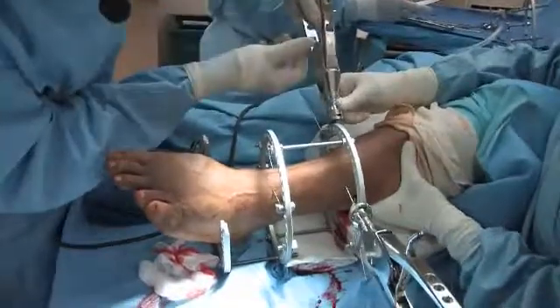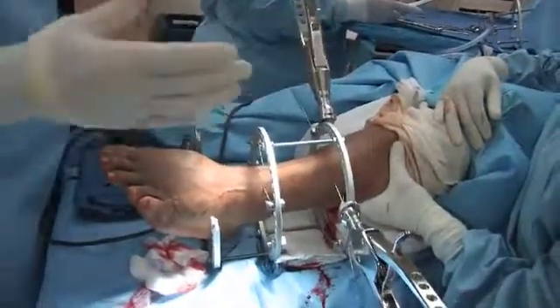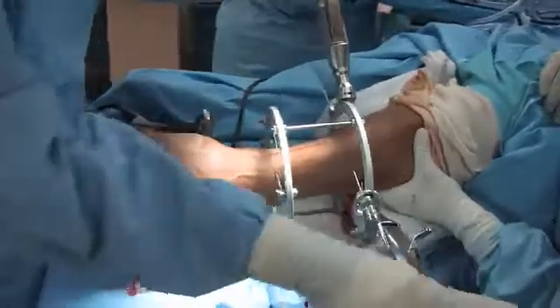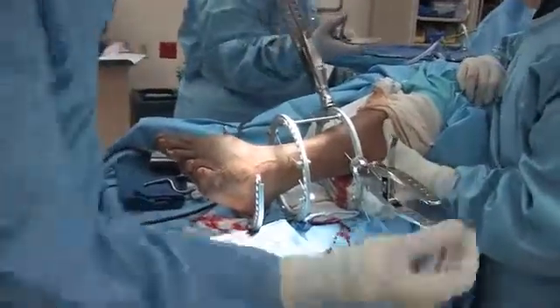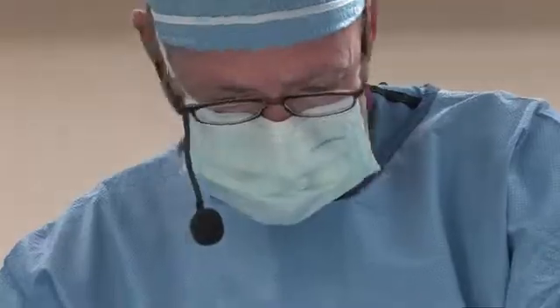So when we're doing these tibial ring blocks, majority of the foot cases, we're going to do this tibial ring block in the same fashion, the same order every time. This just gives us a good firm base to work on to secure our foot plates from. Wrenches. Let's go ahead and cut our wires.